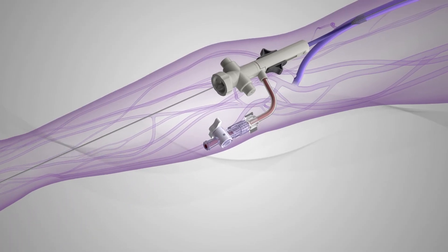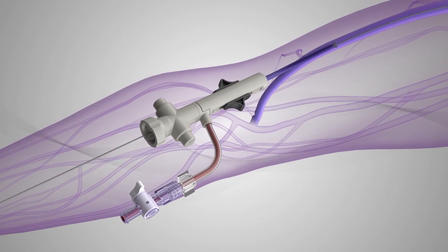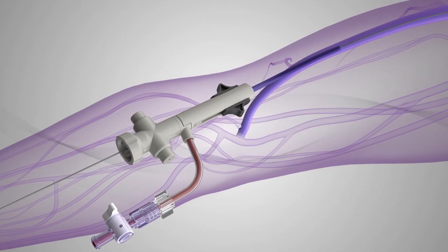After treatment of the venous outflow, the Inthril sheath funnel is recaptured by placing the black tabs in the distal position.